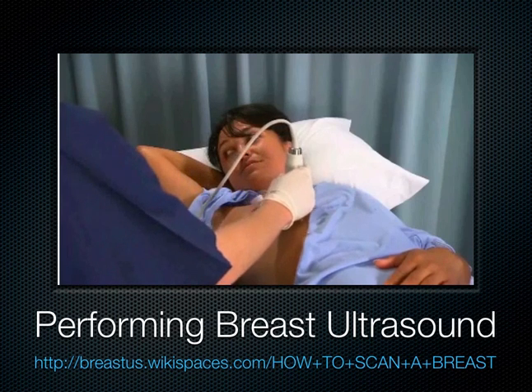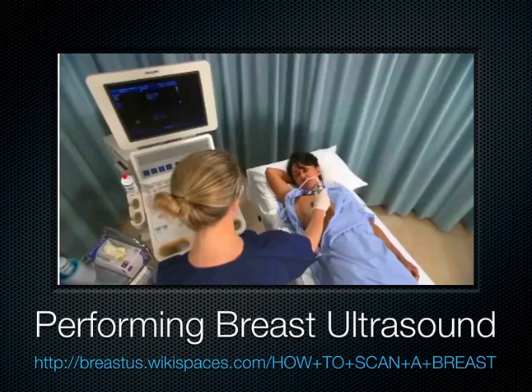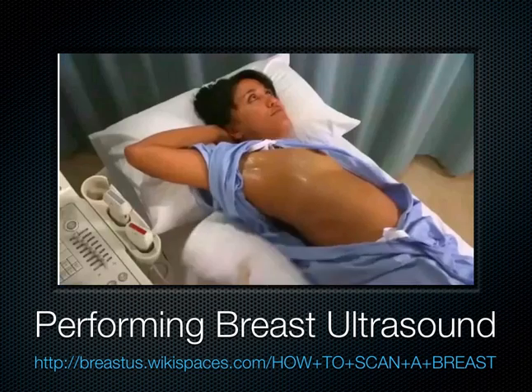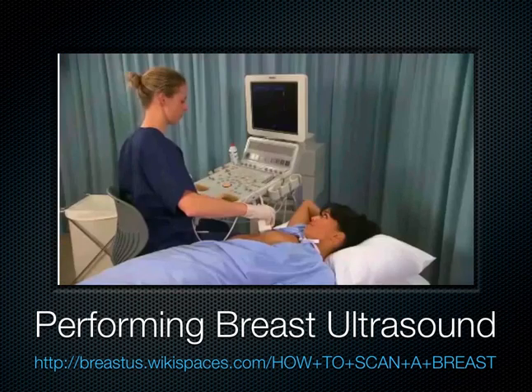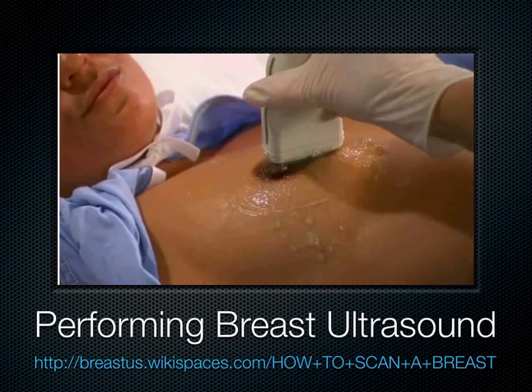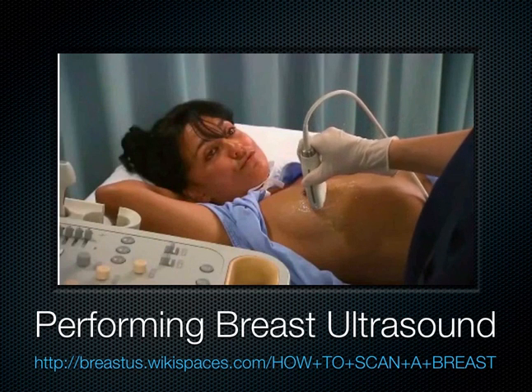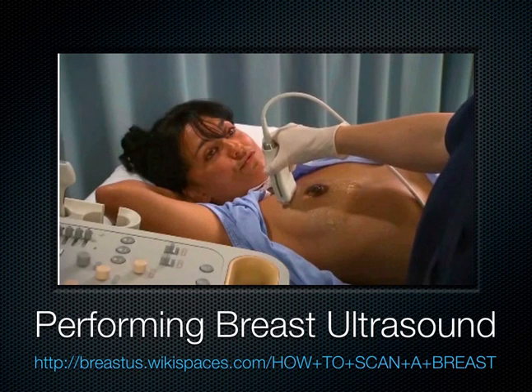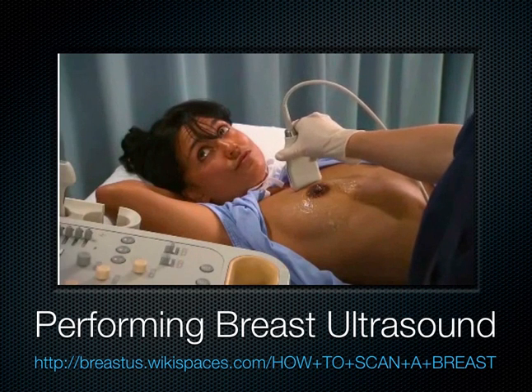Scan the inner aspect of the breast or medial quadrants in the supine position with the ipsilateral arm raised above the head to maximize the image quality. Roll the patient into the supine oblique position to scan the outer aspect of the breast or the lateral quadrants. Scanning the breast in the radial and antiradial planes is exclusive to breast ultrasound. The radial imaging plane is arranged in a wagon wheel pattern with the nipple at the center. The radial plane is parallel to the ductal system and is extremely useful for detecting ductal lesions. The antiradial imaging plane is oriented 90 degrees to the radial plane and perpendicular to the ductal system.